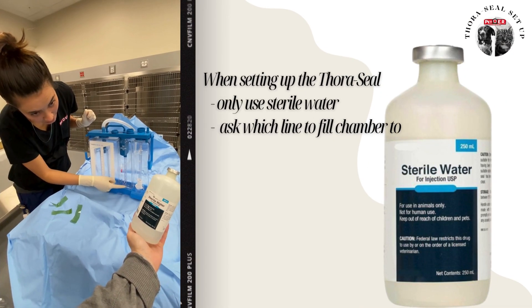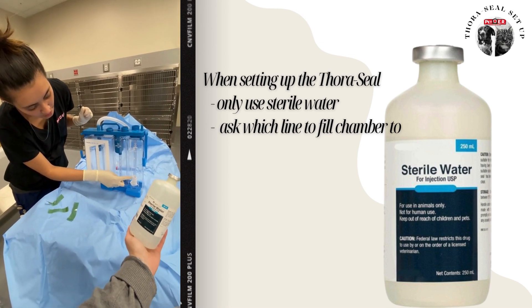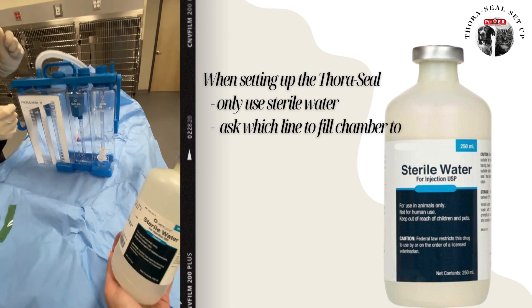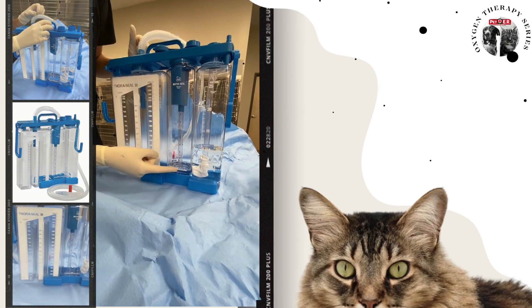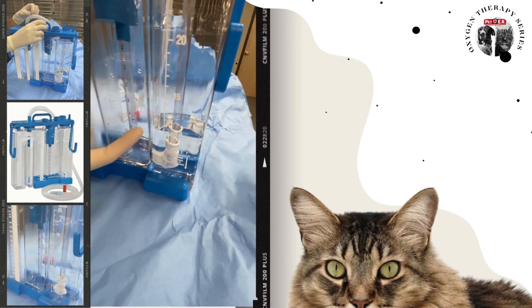You fill it up with sterile water, and then you're going to ask your doctor if they want it filled up to 10 or to 15 — that gets filled up with sterile water as well. We fill it up to this line right here, and our doctor ordered it to 10 centimeters of water.